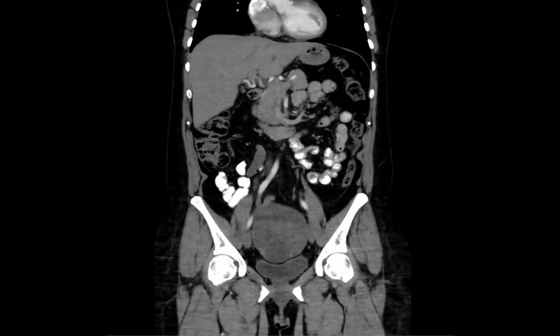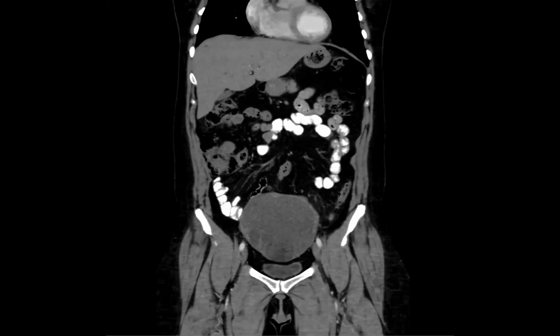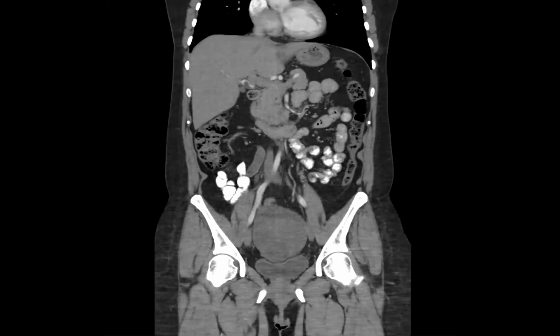Right there. There's your mucocele. But I feel that mucocele can't metastasize to that ovary like that. Can it? Okay, I didn't know this, but it can, and apparently it has to do with the nomenclature. So this patient had all this resected and had low-grade appendiceal mucinous neoplasm, LAMN.